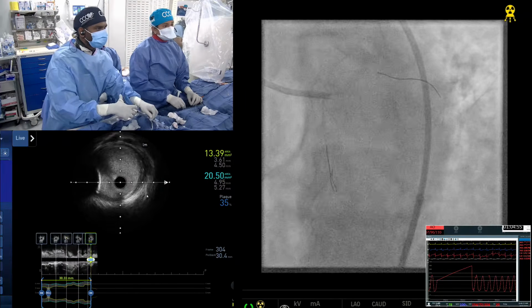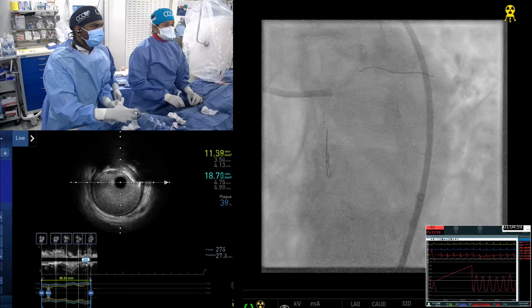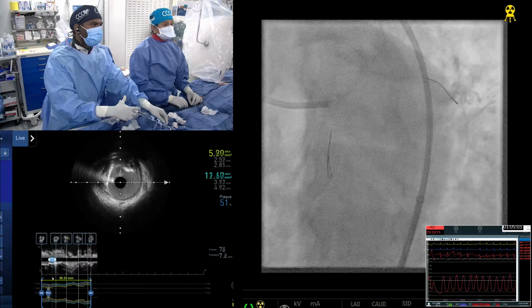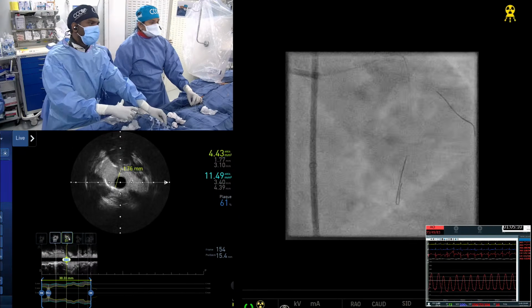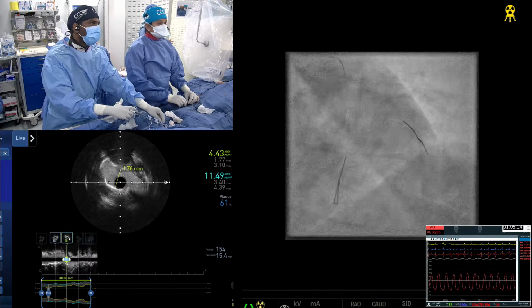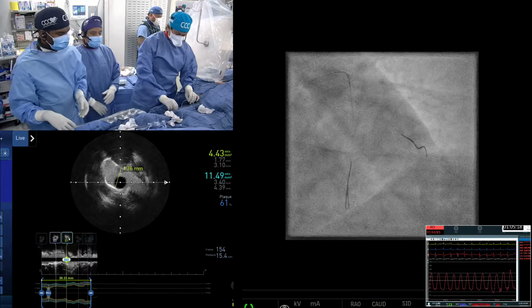Now the question is that we know once you use the cutting balloon alone in this calcific lesion compared to IVL, the lumen MSA was lower. So cutting balloon basically lost in these cases against IVL. But if you did rota, your cutting balloon and IVL will have the same outcome. So that's a good advantage which we learned from the study.